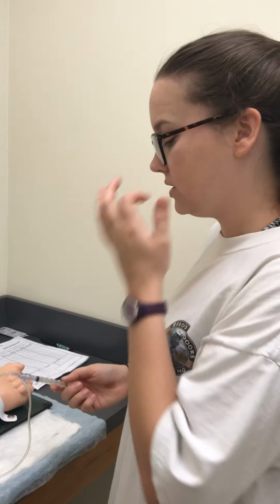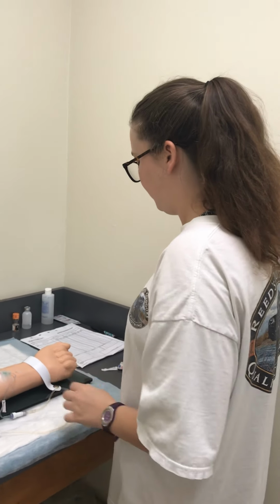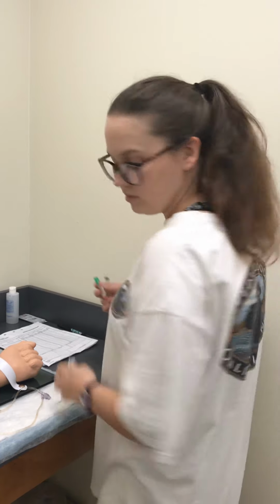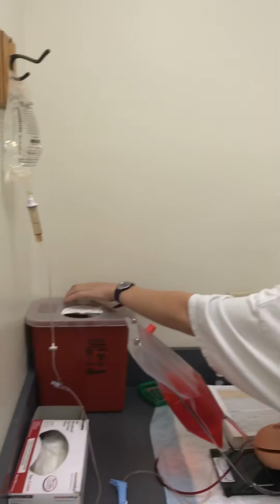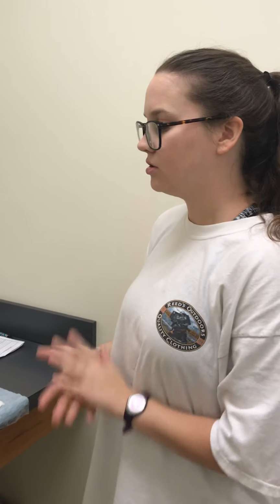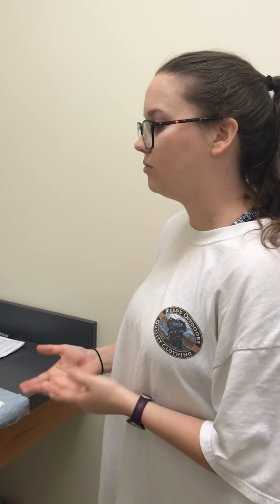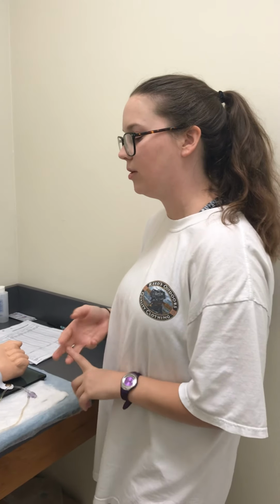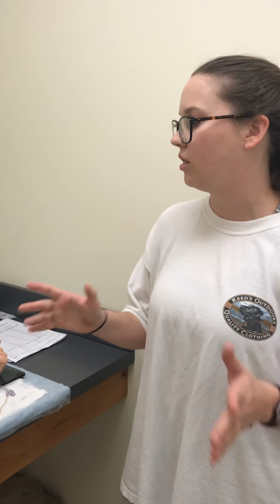Okay, I'm observing the site. I'm going to take the syringe out, dispose of everything. I'm going to put my needle in the sharps, and I'm going to lower my patient's bed, make sure side rails are up, wheels are locked, and I'm going to again remind him to let me know if he experiences tarry stools, weight gain, or edema. And I'm going to document everything I've done, and that's the end of it.